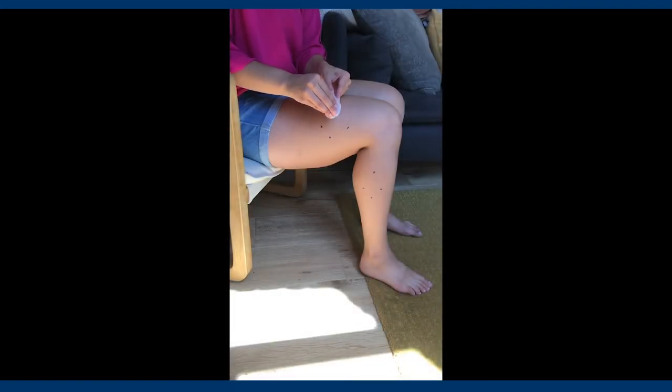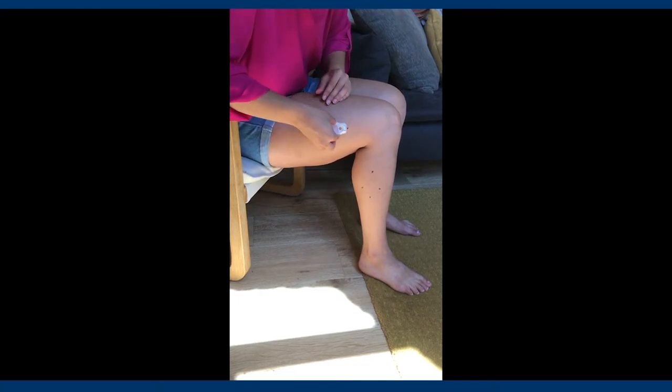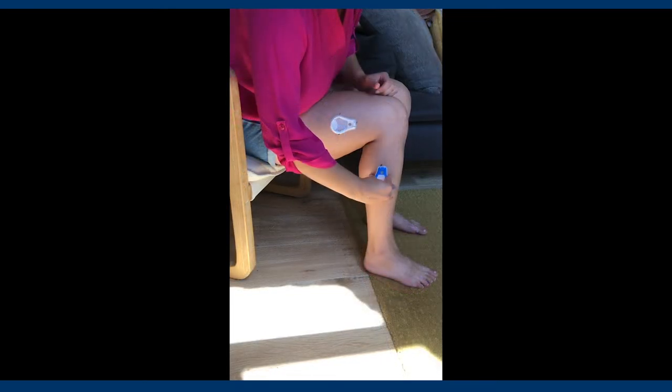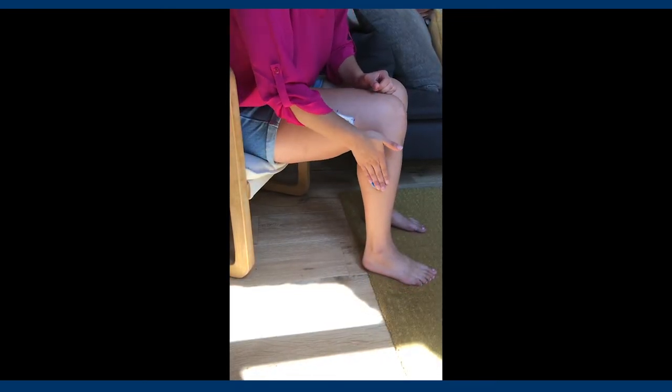Once the area is clean and dry, you will use the marks that you just made to line up a new set of ADPs. It is important to ensure that the blue patch is always placed below your knee and the white patch is always placed above your knee.